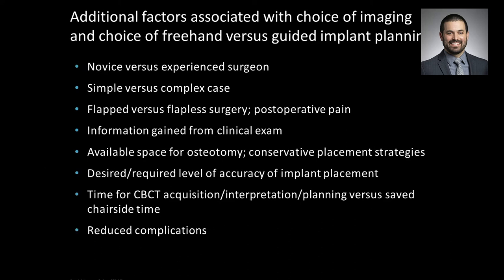I'm skipping over basically hours and hours' worth of research and discussion here, and I bring these points up for you to consider in your own practice if you're getting started or actively engaged with implant placement. What are the factors influencing your specific setup, and how might you use imaging or not to move forward?